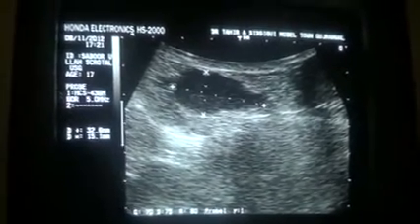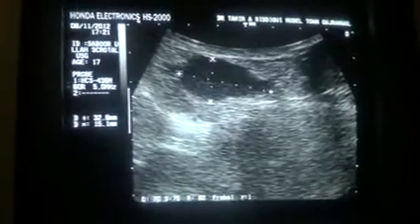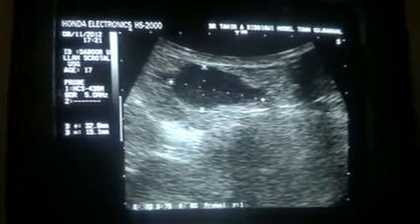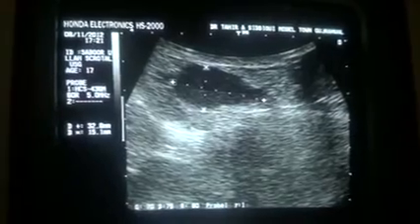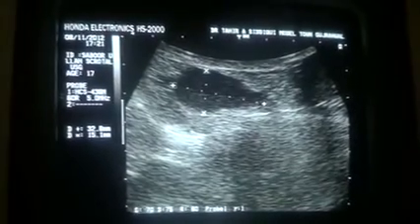When we compare it with the left testis, it is much softened out. So this is our case of the day. Thank you.